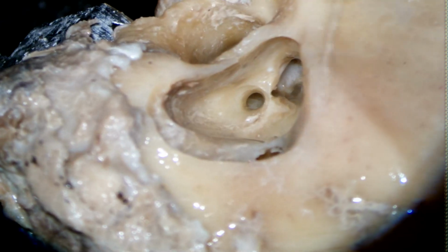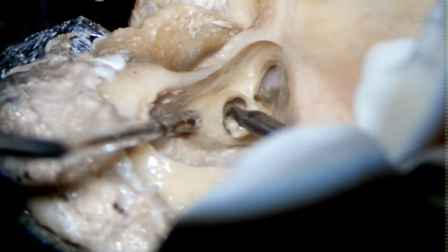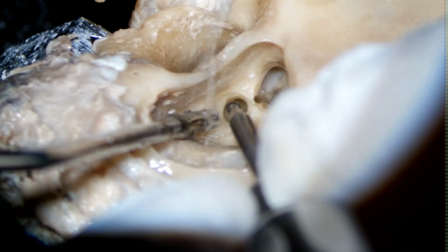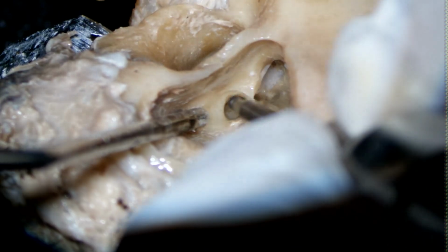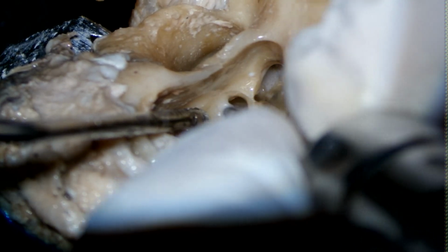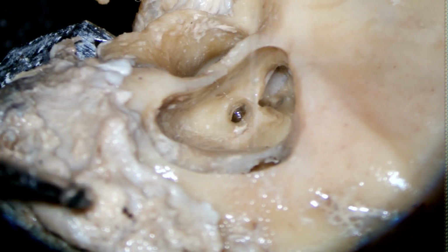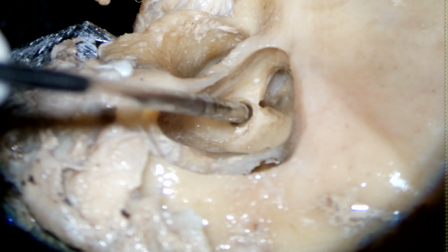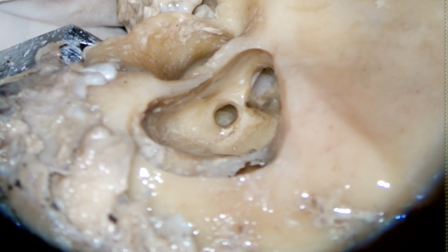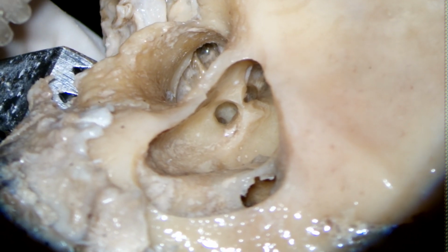It looks like the promontory bulge. Looks like promontory. Let me widen it. At this point, you have to see in the posterior and the medial part, right, to see the round window niche basically. And you might have to turn the head of the patient.